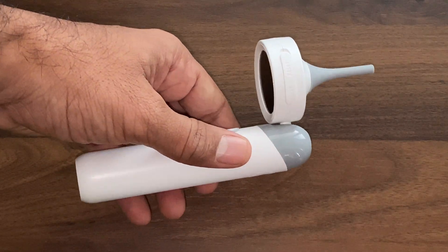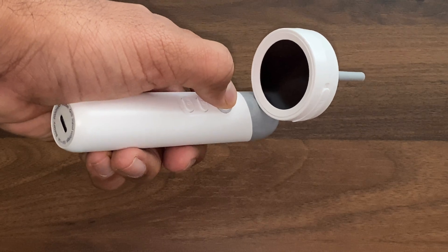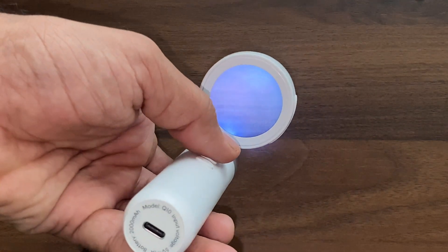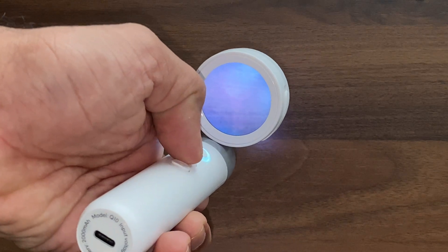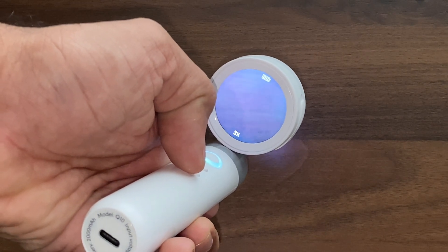Initially when I saw this instrument on Amazon, I thought it was fitted with a magnifying glass — but it is not a magnifying glass, it is an LCD screen.